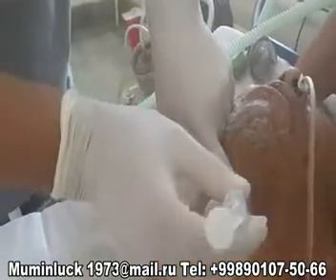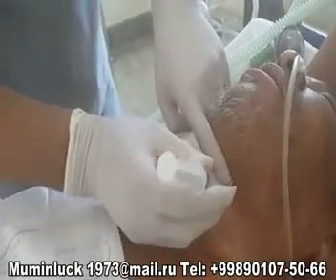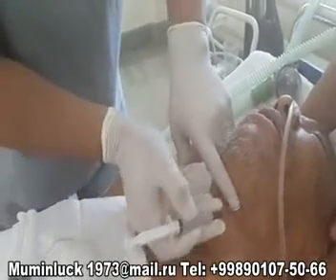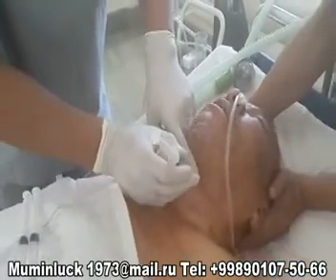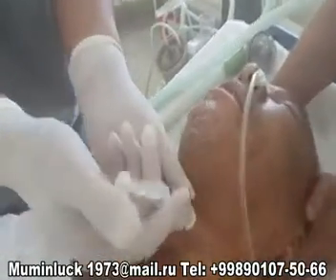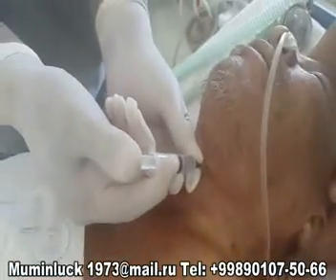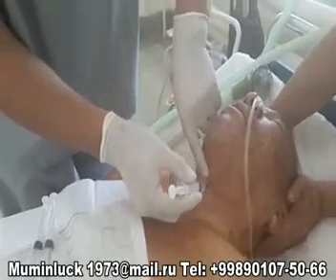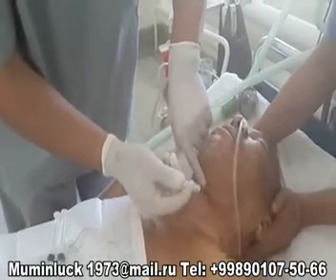The block is performed by infiltrating local anesthetic one centimeter below the greater cornu of the hyoid bone. This is where the superior laryngeal nerve divides into its internal and external branches, prior to the internal branch entering the thyrohyoid membrane. For this blocking procedure, we usually use four milliliters of two percent lidocaine.